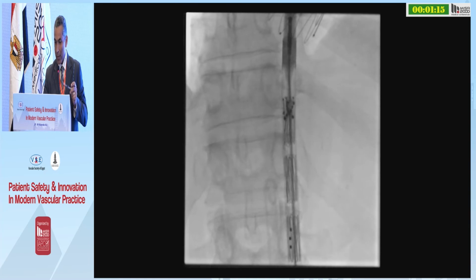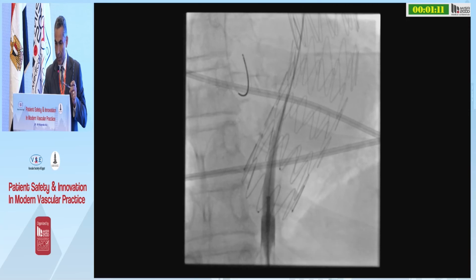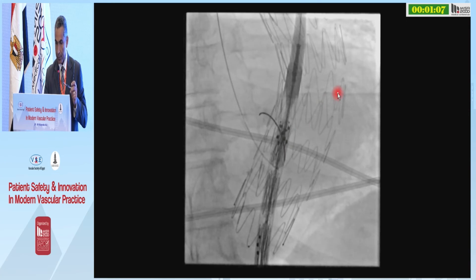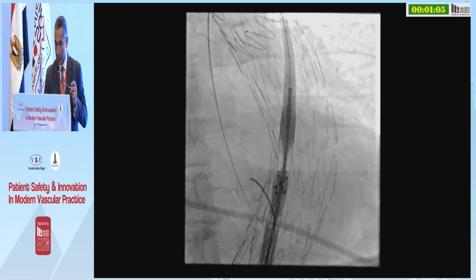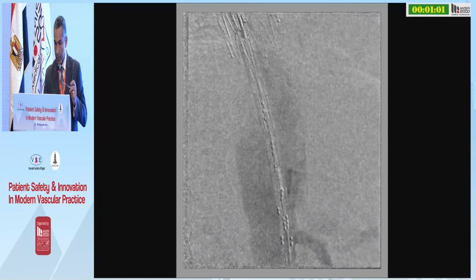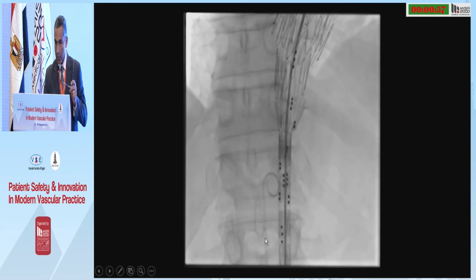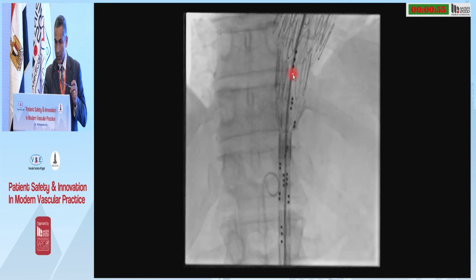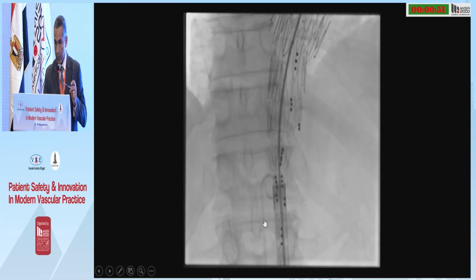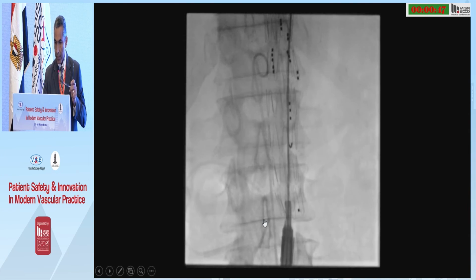All the markers should be anterior, the 3 markers above the branches and below the branches. You all know these markers, and the SMA, and we start with the 3 markers. Here and there should be anterior. Then you start to deploy, and then you start to cannulate.